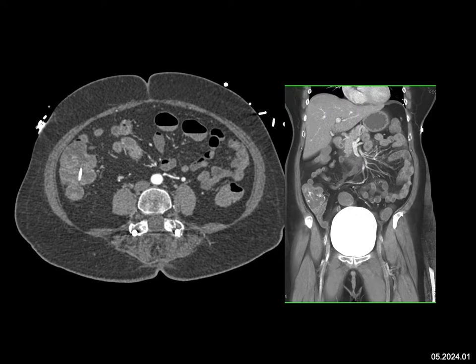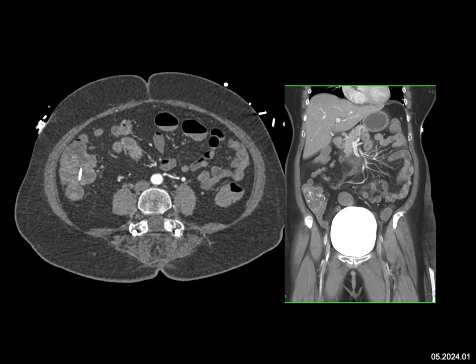You also can have bleeding, and the patient may just have symptoms because colonoscopy is not the friendliest of exams. In this case, you can also worry about pneumoperitoneum, but in these images I don't see pneumoperitoneum. The spleen I partially visualize — I don't see blood in the left upper quadrant, so splenic trauma is not something I'm thinking about. I do not see evidence of a retroperitoneal bleed.